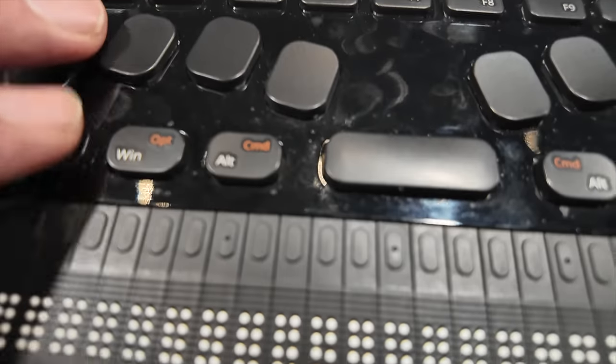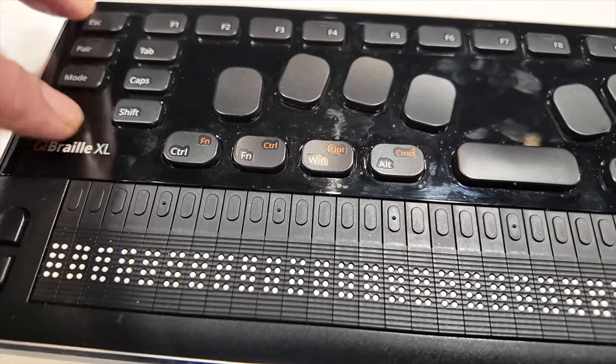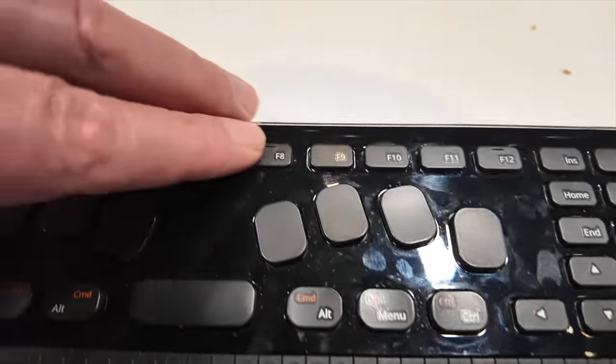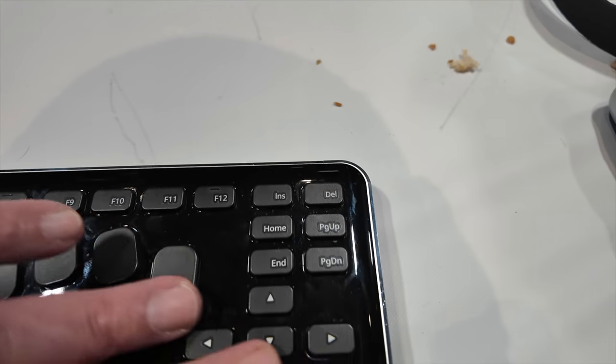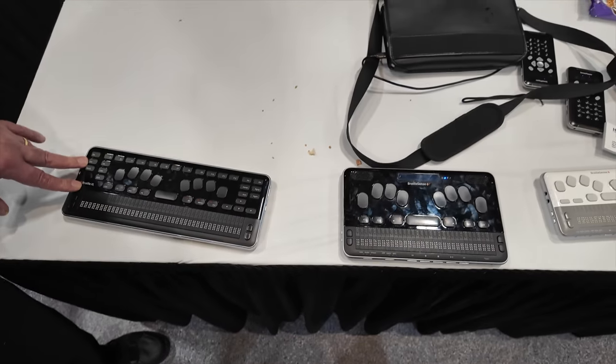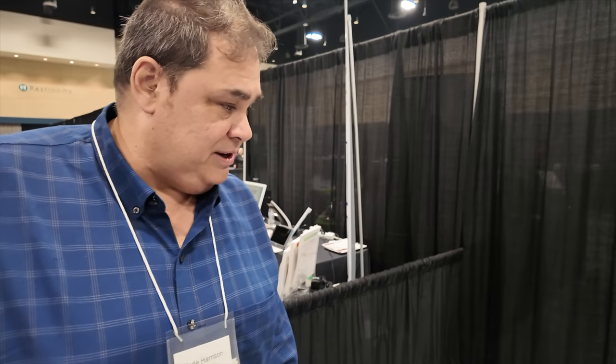Instead of the numbers and the letters you would be accustomed to on a regular computer keyboard, we have a Braille keyboard. Yet we have all the extended QWERTY keys that you would have on a regular Macintosh or Windows keyboard. What that does is it's actually an ergonomic consideration, because instead of having to go back and forth between the keyboard and the Braille display, you can just do everything from here.